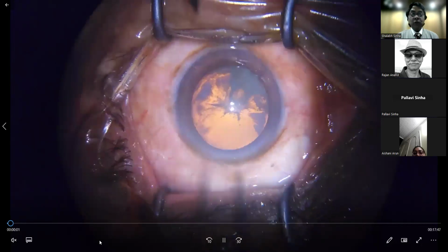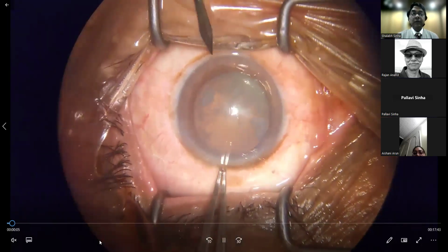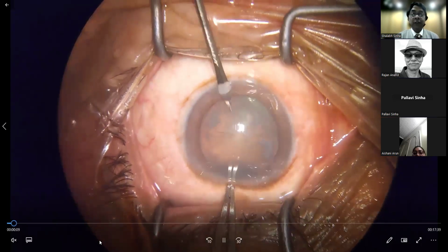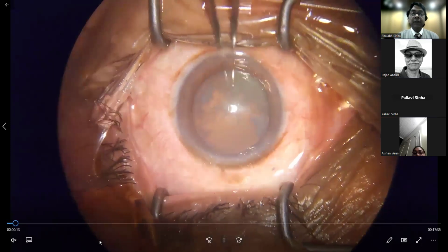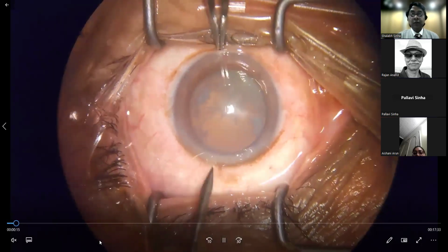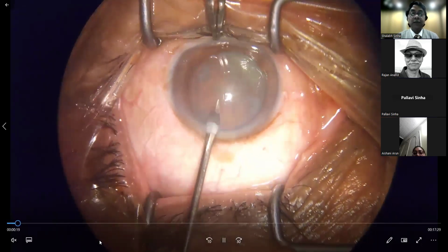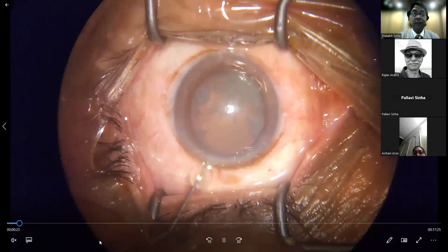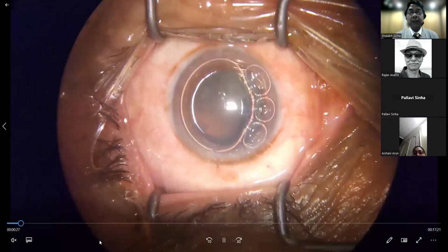I sit temporally and the side port incision is made with the MVR blade, almost 180 degrees apart, just within the limbus. The Hoskins forceps provides the counter pressure from the opposite limbus.